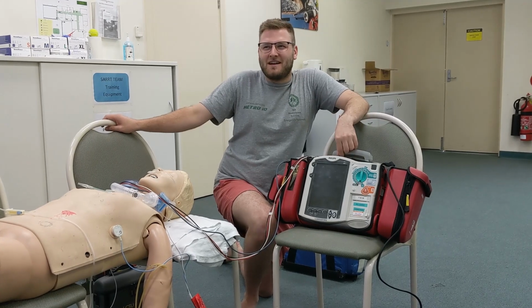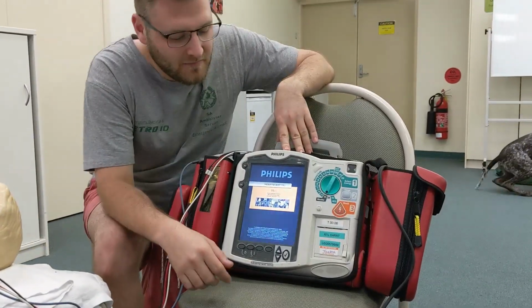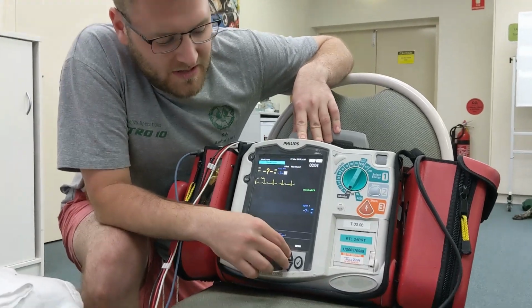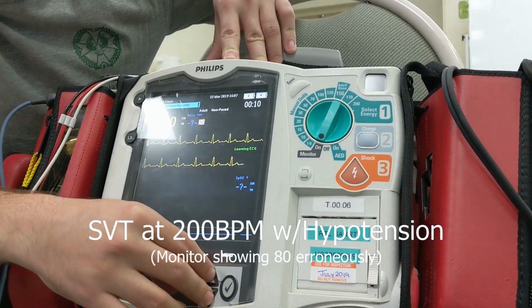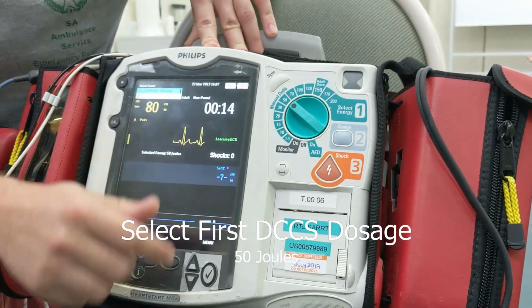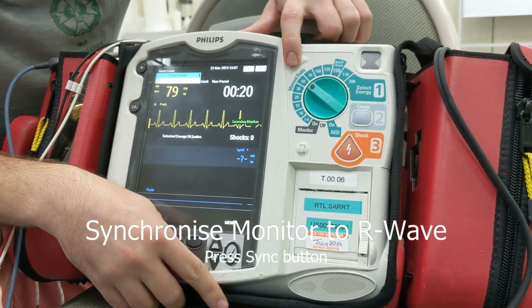The defibrillator should then be turned on. Obviously, we'd have this in monitor mode, have the 12 lead done first. This is going to pop up and say that we're in a normal sinus rhythm, but let's say that we are in an SVT at a rate of 200 with a blood pressure of 60. The next thing we're going to do is dial this up to the first dosage of joules, which will be 50. And the next thing we're going to need to do is synchronize the monitor to the ECG.